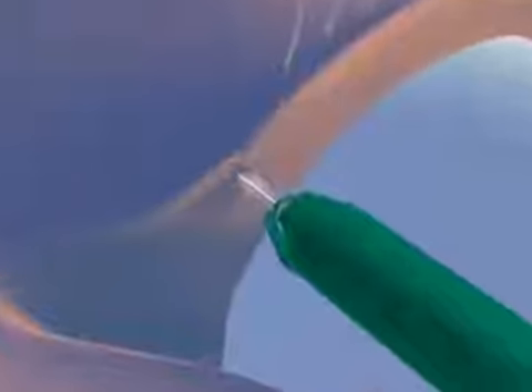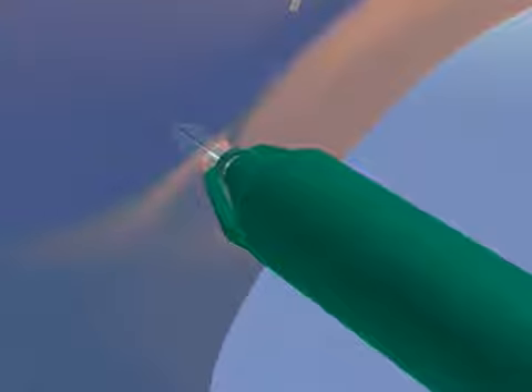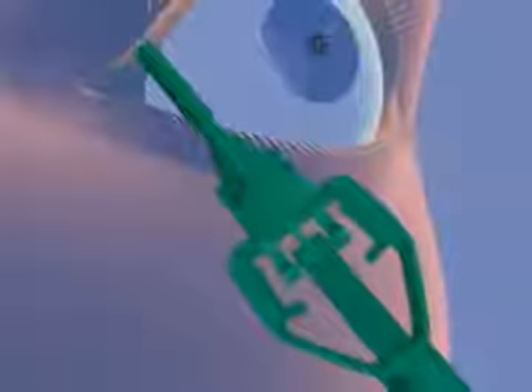Fitting the painless plug is simplicity itself. Start by inserting the painless plug in the punctum using the plug inserter. Once the painless plug is correctly in place in the punctum, squeeze the fingertip controller until the arms touch the body of the plug inserter. The gripper retracts and releases the plug, which then returns to its original shape in the ampulla.